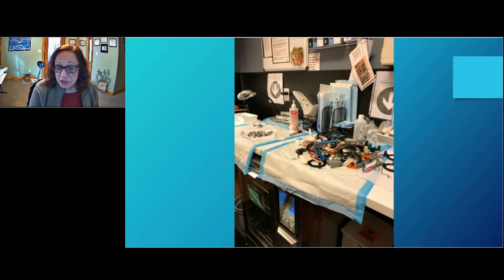So here we have a picture of some dental instrumentation. You can see the washer down here below the countertop. On the opposite side in this sterile processing area is their sink where they're actually washing their instruments. Because their washer, like the ultrasonic, did not decontaminate, they inspected on the dirty side, or in the dirty area. They also handled these instruments with PPE and packaged the instruments with PPE because they're contaminated still.